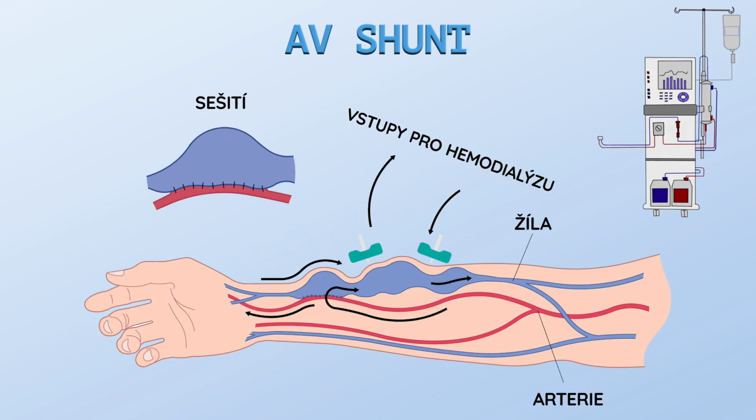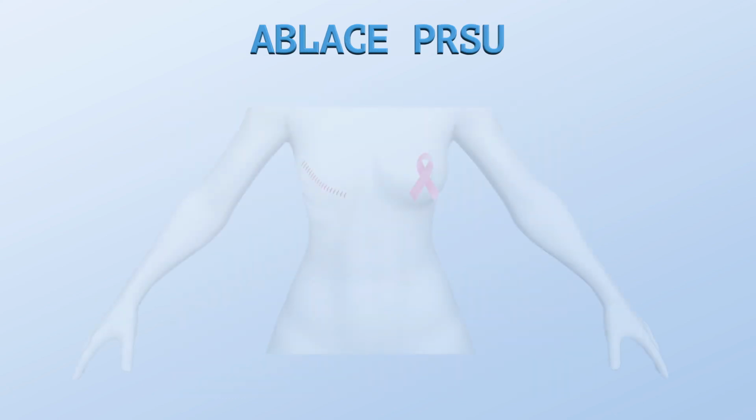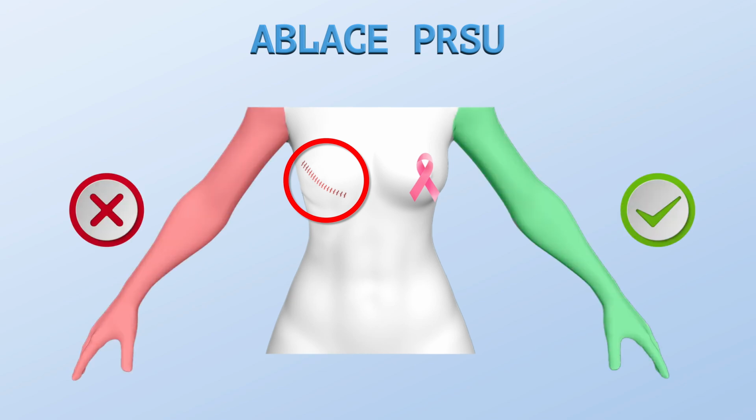Patients are also at risk if venous access is limited to only one side. The insertion of the catheter is contraindicated in veins on a limb with an AV fistula. Insertion should also be avoided in the paralyzed limb or on the side where a breast ablation has been performed.